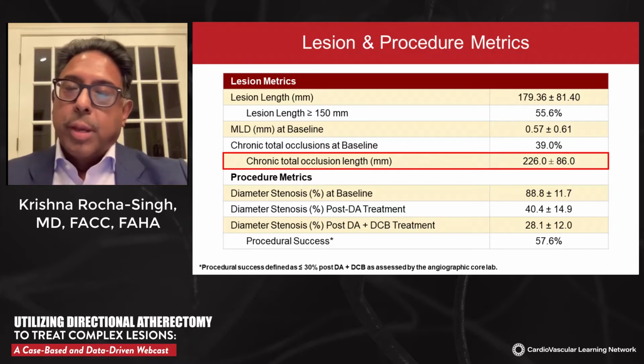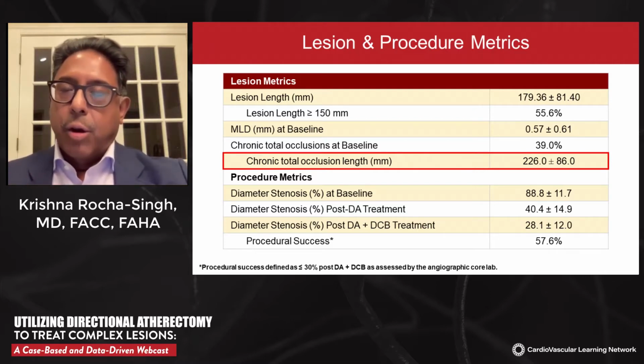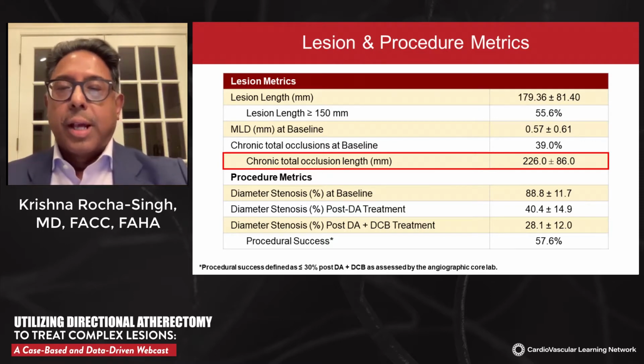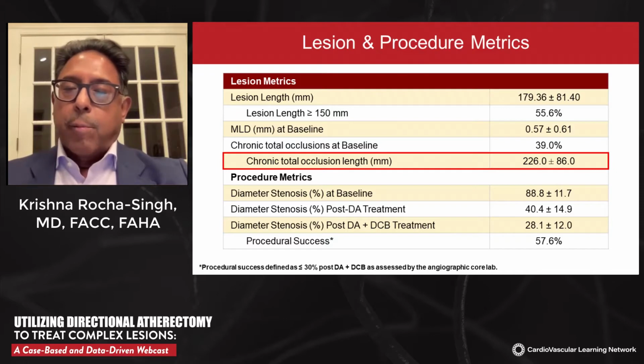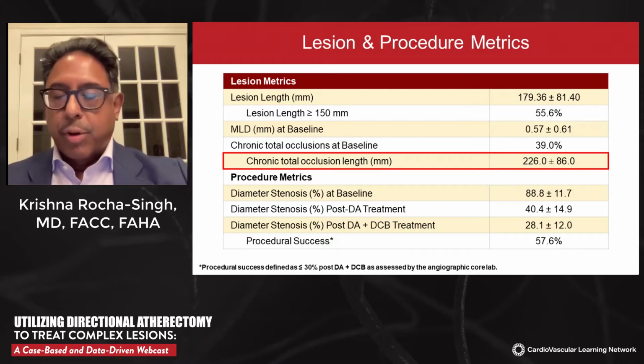And that was basically a signal that was derived from the DEFINITIVE AR trial, which we will discuss a little bit later. So importantly, you can see that at every stage we looked very closely at the procedural metrics as a result of both atherectomy and the DCB.